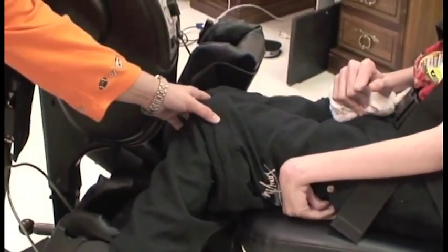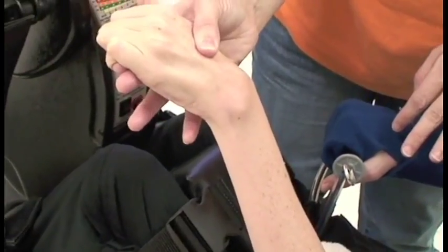You can't really move it much at all — he doesn't move. His leg won't straighten, and his knees are locked together. His hands are as high as he can get them, up to about between C and B, but it's very stiff.